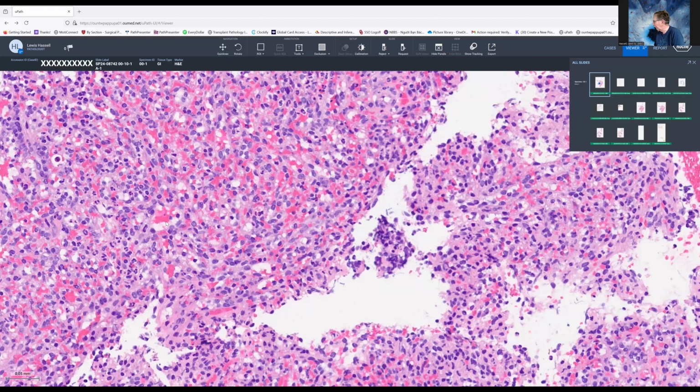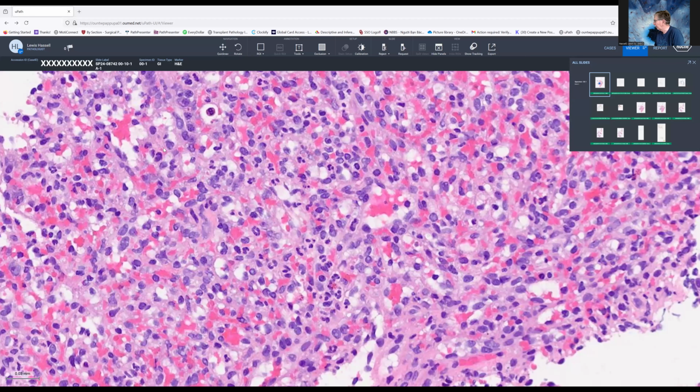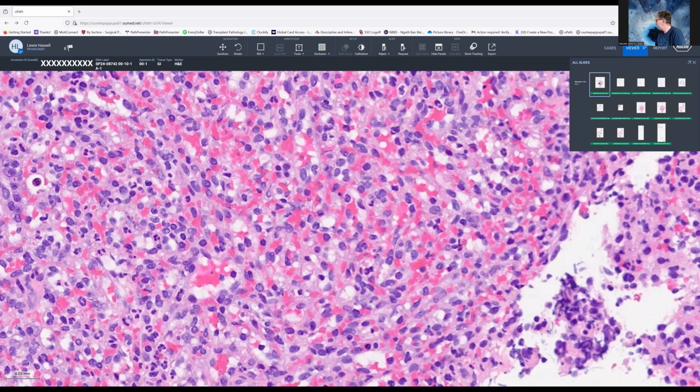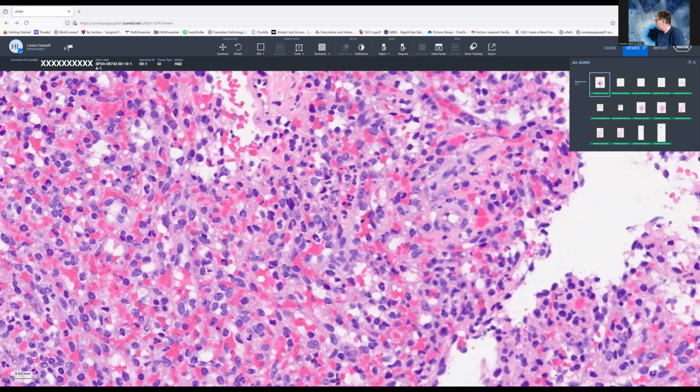We see some blister cells, little bubbles in some of these cells, and a mixture of a few inflammatory cells in the background, but a lot of vacuolar changes and fairly low-grade appearing nuclei that appear to be forming this very vascularized backdrop. Now, there's not a lot of hyaline tissue here and so forth.